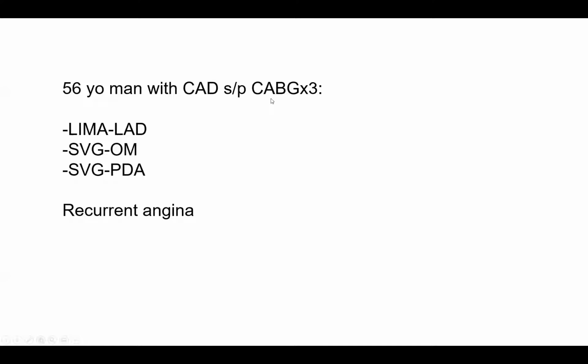This is a man with a 3-vessel CABG 5 years ago, LIMA to LAD, vein graft to OM, and vein graft to PDA, right PDA. He's coming with recurrent angina. So I will explain how we did this case.